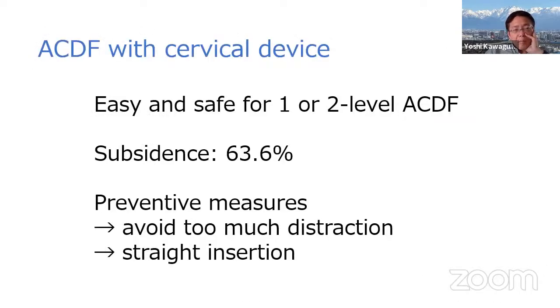ACDF with the cervical device is very easy and safe to handle for one or two levels. However, we must pay attention to subsidence of the device. To prevent it, avoiding too much distraction and straight insertion of the device are very important.